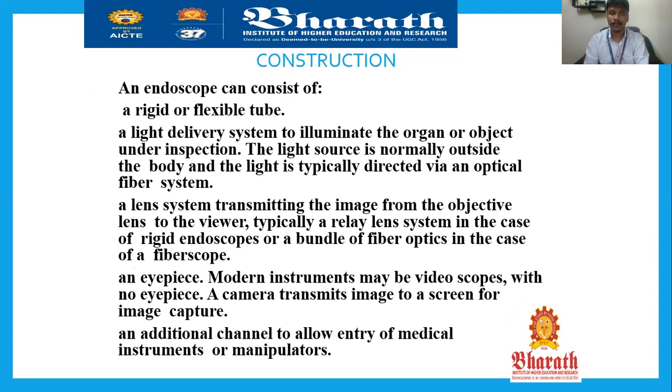Construction. How the endoscope is constructed, and how it is developed as equipment for viewing internal organ physiology and human anatomy through pictures. Actually, endoscopy does not come under medical imaging techniques.